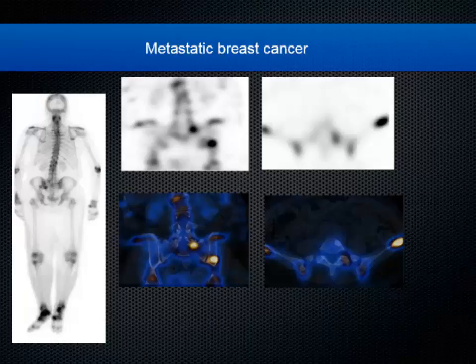So this patient is on a treatment, so therefore some lesions, if they become strictly very well sclerosed, for example, if the Hounsfield unit is around 200 or something, it will look normal on a bone scan. So you should not underestimate or overestimate based on just the sclerosis.